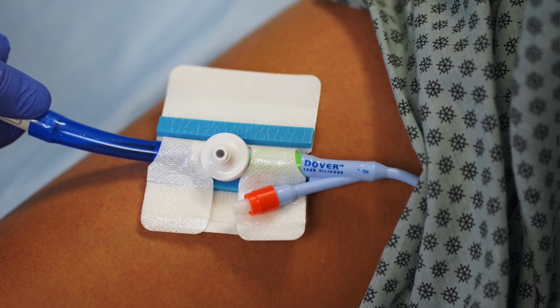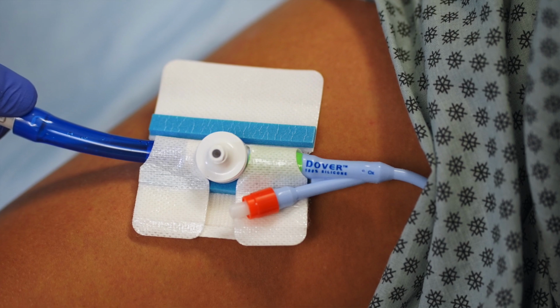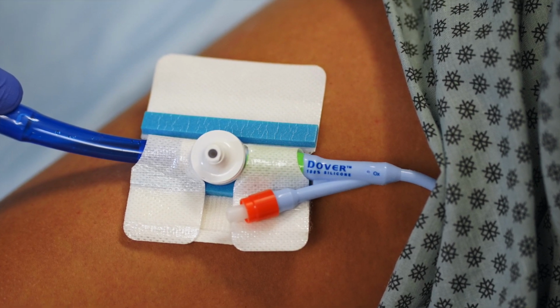There are various catheter securement devices in the market, and you should follow manufacturer's instructions. We will be demonstrating one example of a catheter securement device, Cardinal Health's CathSecure Advanced. The catheter should be secured to the patient's upper thigh. Here we're demonstrating the application of an adhesive catheter anchor pre-attached to the catheter.